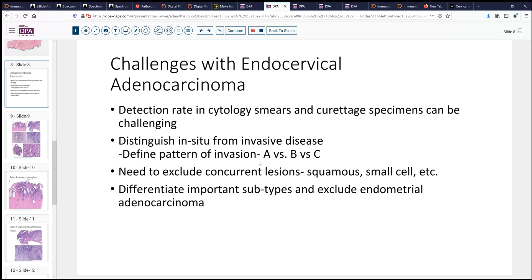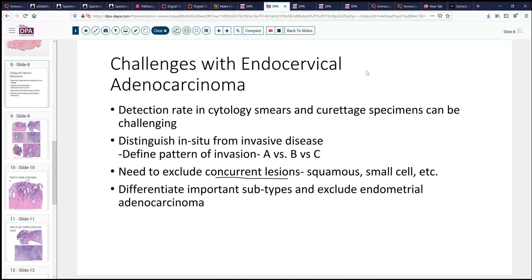With that comes defining the pattern of invasion. This is relatively more recent information in the literature about classifying lesions by pattern of invasion: type A, type B, type C. Each of these various patterns of invasion have a differing risk of nodal metastases, which can be very important when the gynecologist is considering whether they need to do inguinal or pelvic lymph node dissection. We also want to make sure that we don't have a concurrent lesion — adenocarcinoma often goes walking with squamous cell carcinoma, maybe with small cell in some cases, and certainly may have an associated in situ epithelial lesion of a CIN type.